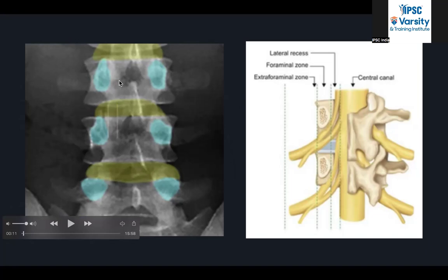The issue is that in the upper areas we have limited access to this lateral recess. When we go through transforaminal or foraminal routes, it is very difficult to decompress it. If the flavum is there, or the osteophytes are there, it's difficult to decompress from there. Interlaminar is the best approach to decompress from posterior, and if the disc is there, we can decompress the disc also. So mostly I do interlaminar in such cases, and this is the area we have to clear, and we'll see how to do that.